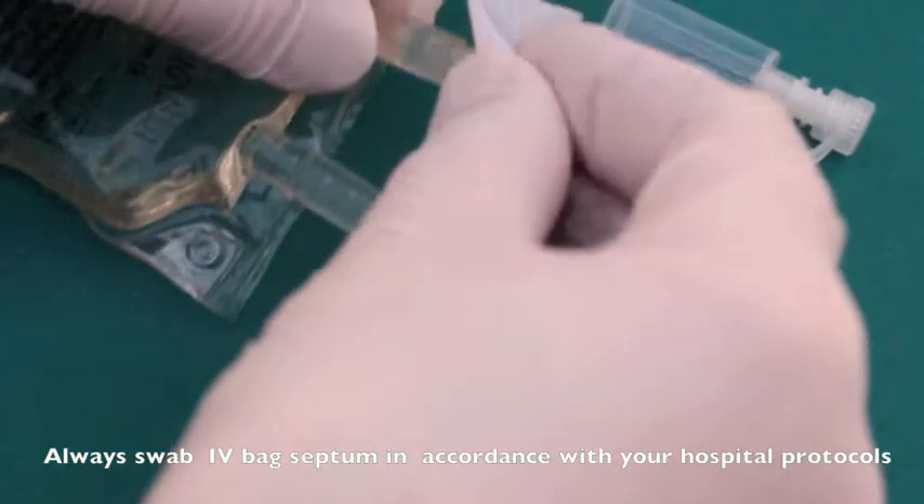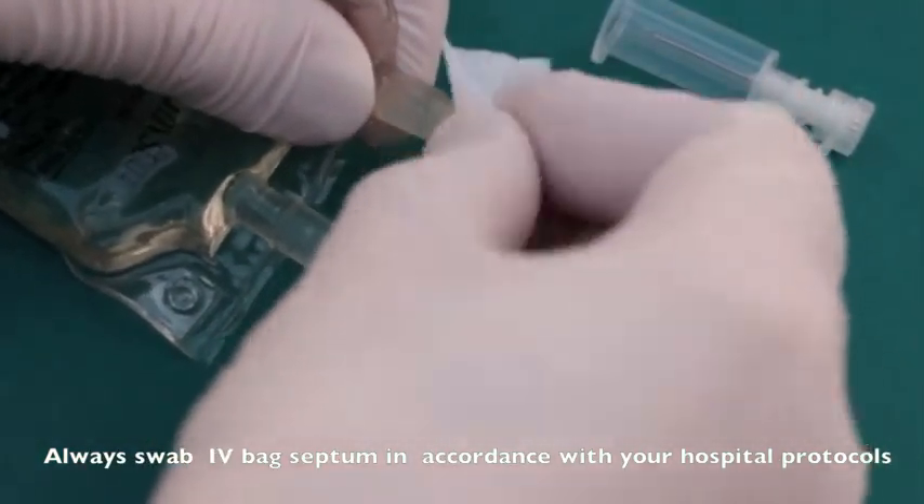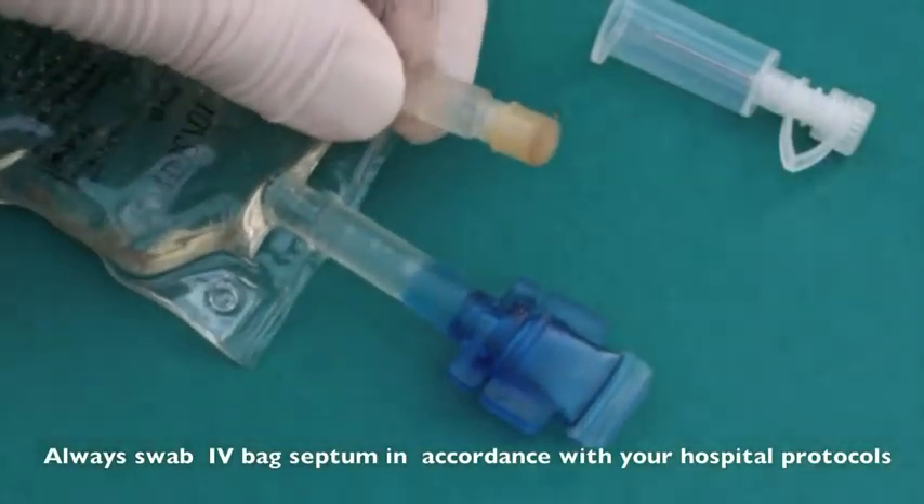As would be normal before injecting into an IV bag, always swab the port septum adequately in accordance with your hospital protocols.